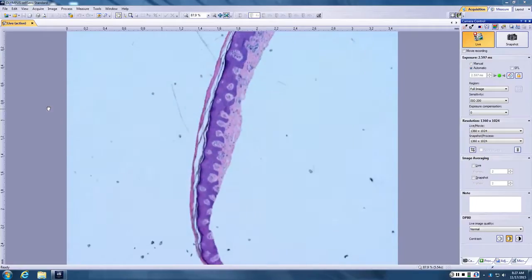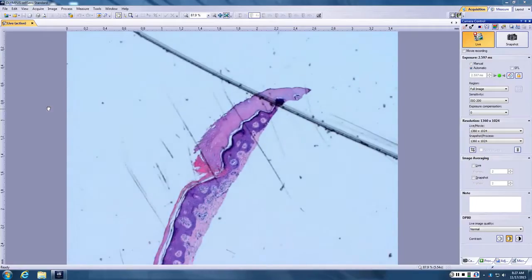So, Ashley. Okay, so that looks like another cornoid lamella. We got Poro. Okay, this is a better cornoid lamella. Remember, the center of Poro can look like anything. Can have epithelial atypia, can be psoriasiform, can be lichenoid, can be atrophic. Center of Poro, like anything. It's all about recognizing the cornoid lamella at the edge.